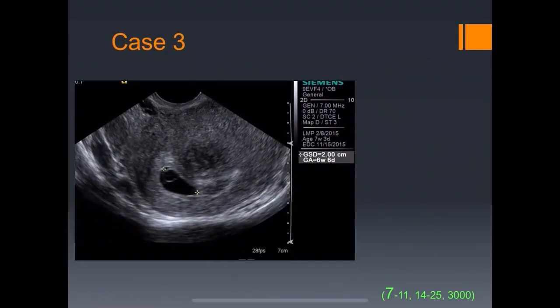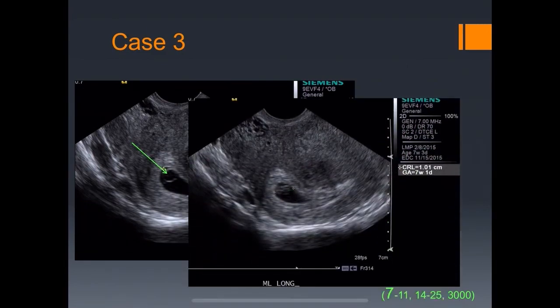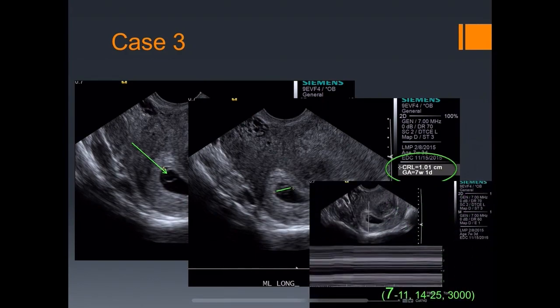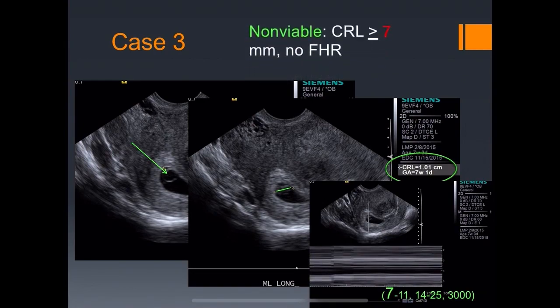Case three: intrauterine gestation with a yolk sac and a fetal pole measuring 10mm, however no heart rate. This takes us to the first important number: seven. If you see a crown-rump length of seven or more millimeters but no fetal heart rate, it is a non-viable pregnancy.